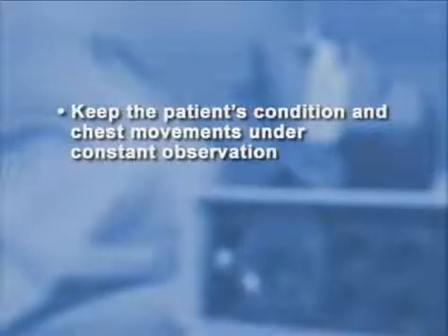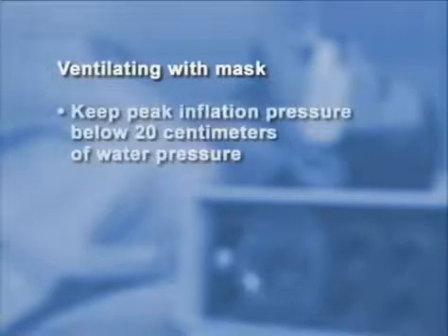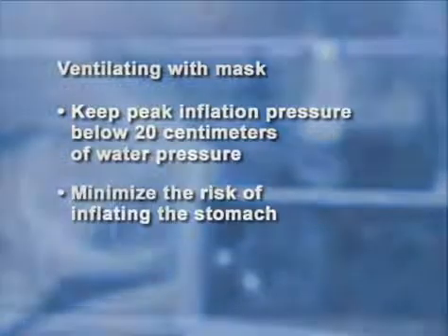Keep the patient's condition and chest movements under constant observation, and check the inflation pressure manometer frequently in order to detect and correct adverse ventilation conditions before the patient is put at risk. If ventilating with a mask, try to keep peak inflation pressure below 20 centimeters of water pressure to minimize the risk of inflating the stomach.